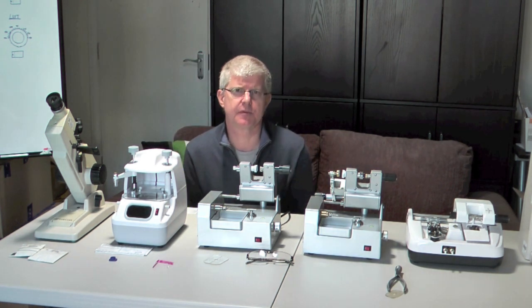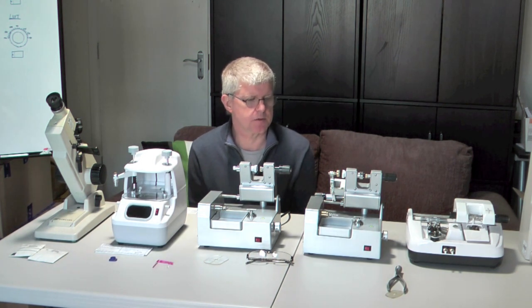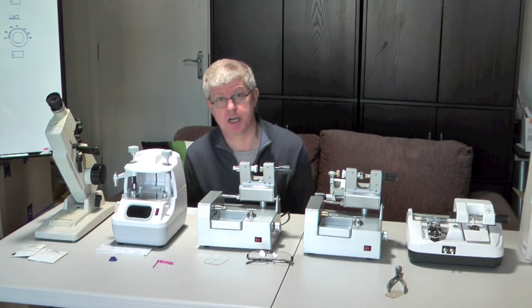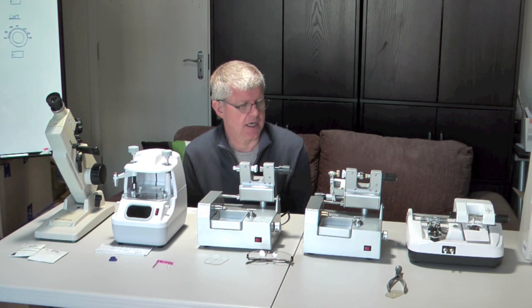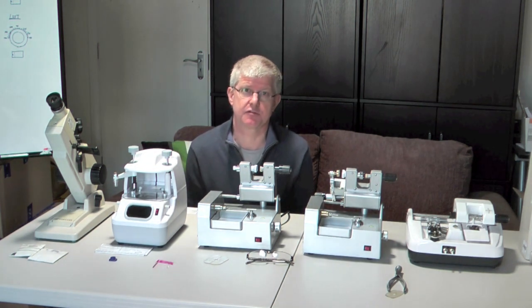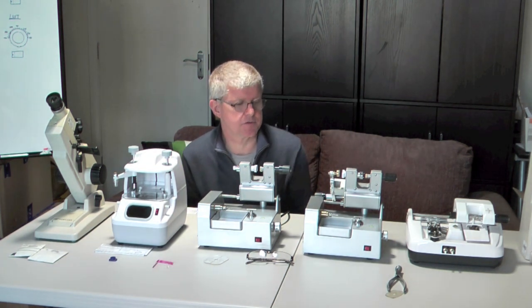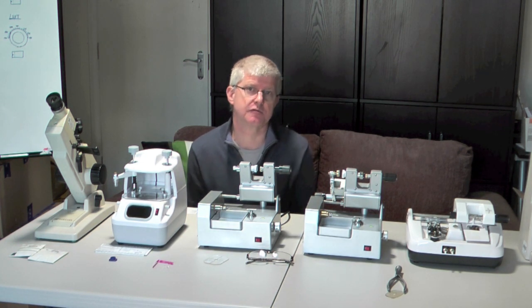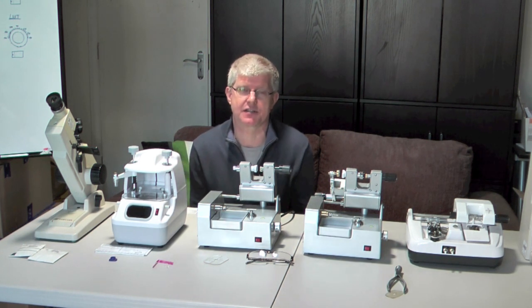We've been putting together a few videos to help people learn about providing primary eye care services to remote regions in Africa or other third world countries. We've been doing studies on refraction, how to do subjective refraction. But once you've learned how to do refraction, you then have to make the glasses. So this is a video that will help us understand how to make glasses.